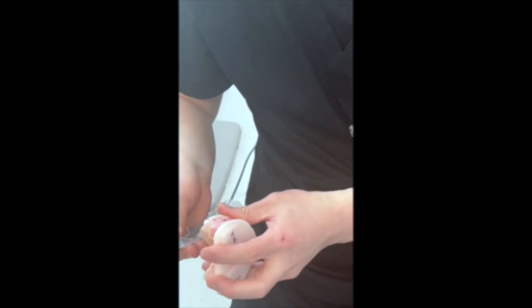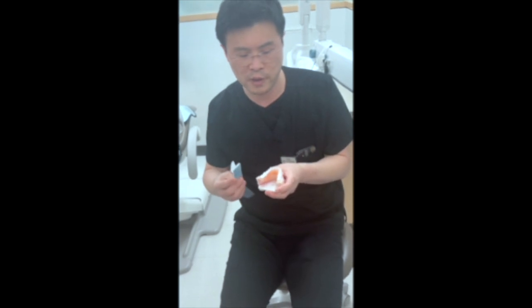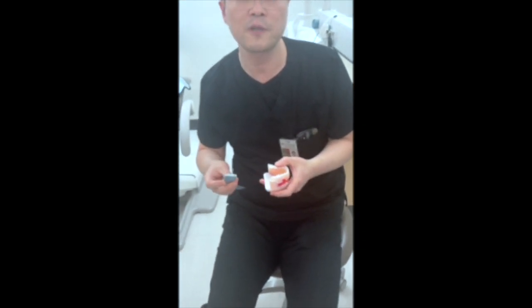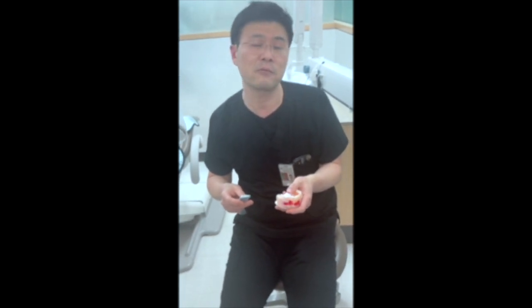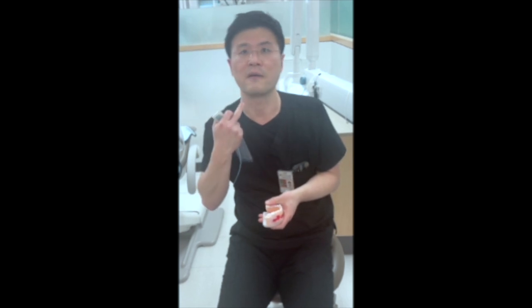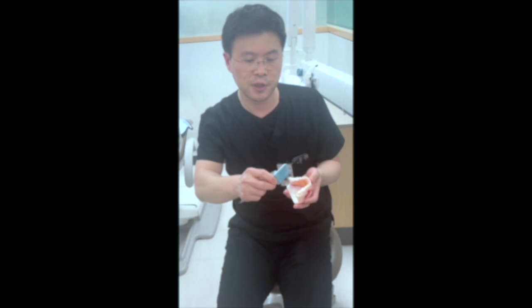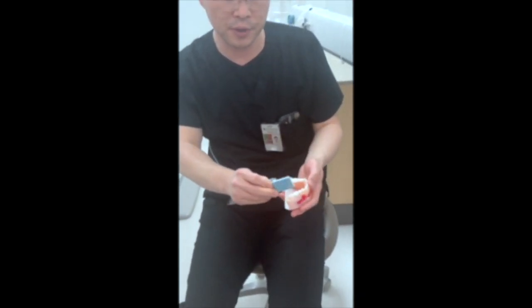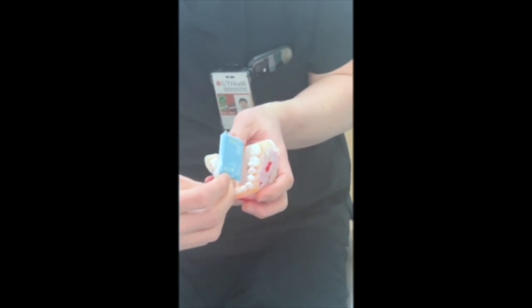Now we'll shift to radiographs for mandibular molars or premolars. It may be a bit more difficult. Now we're dealing with the tongue, which can make things more difficult. So when you put your sensor, as we're showing in the video, first, it's very important not to put your sensor on the tongue.